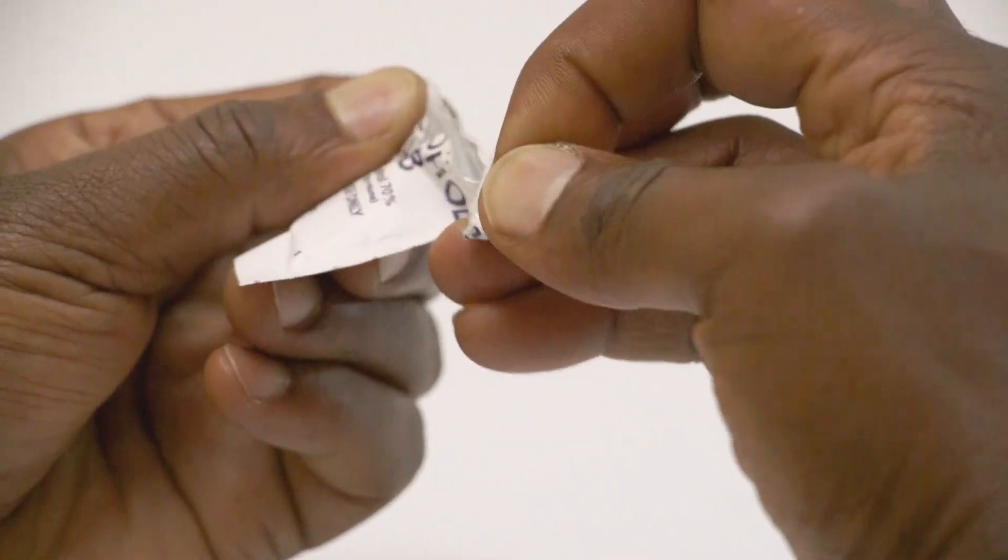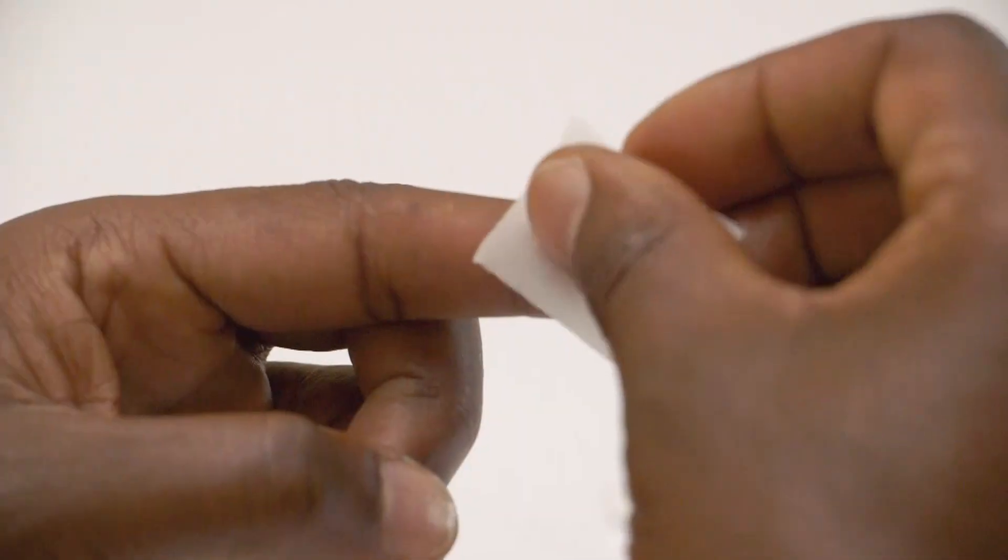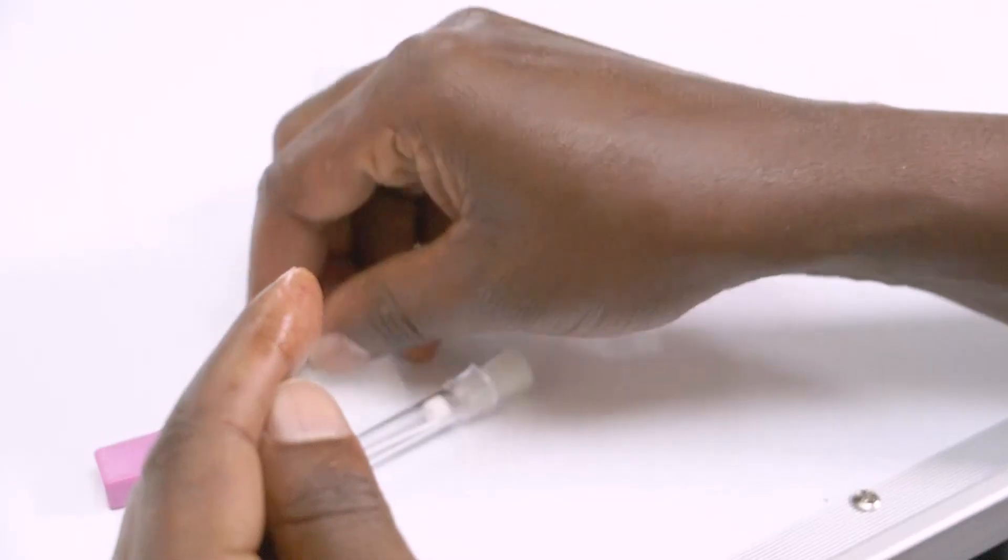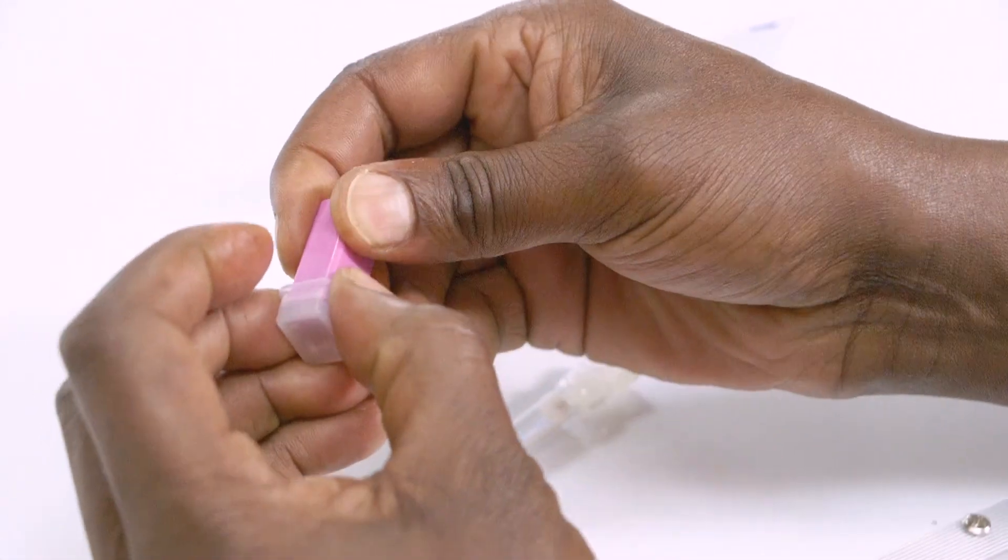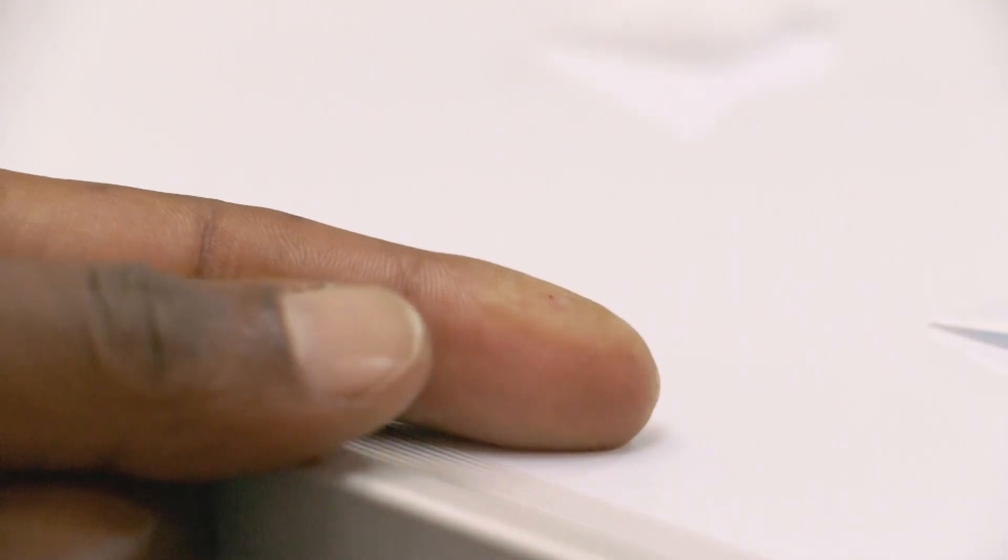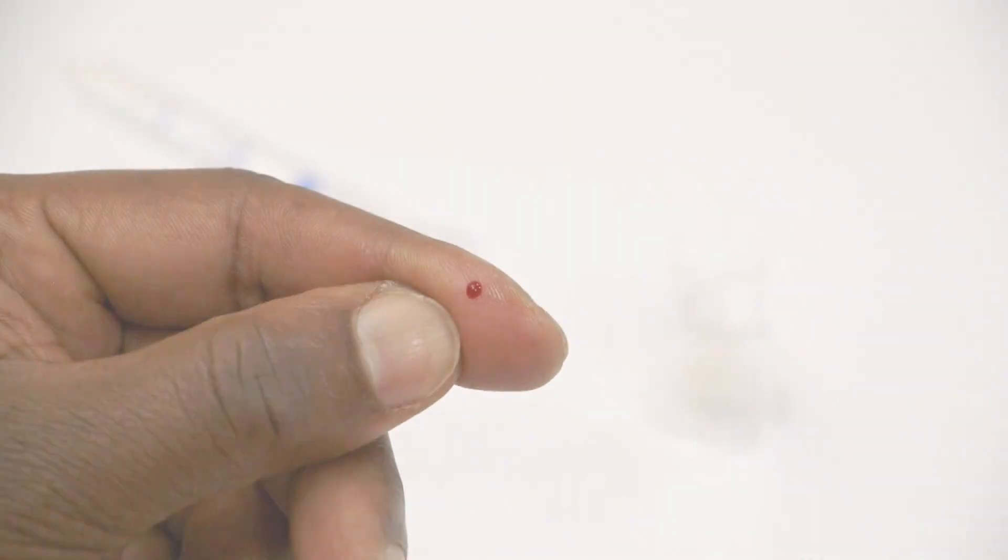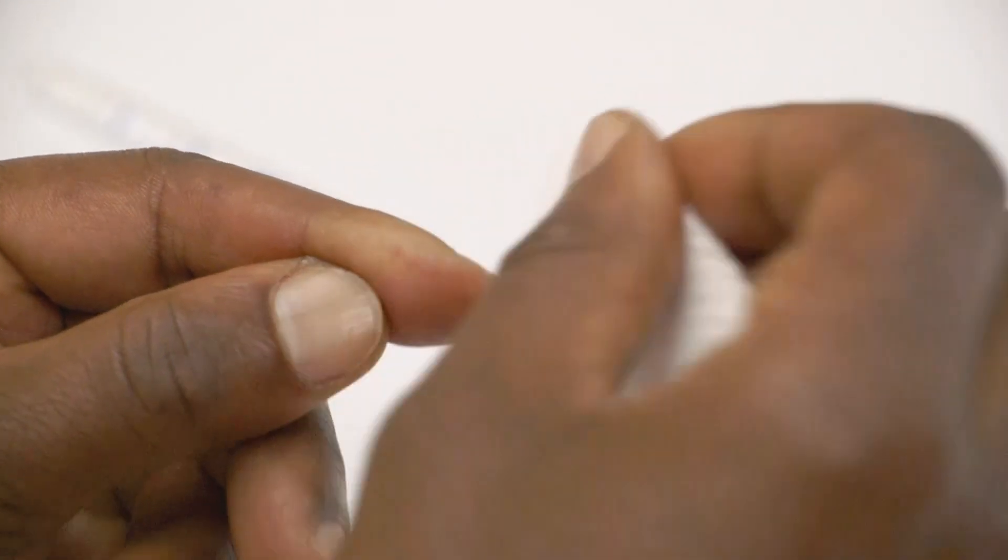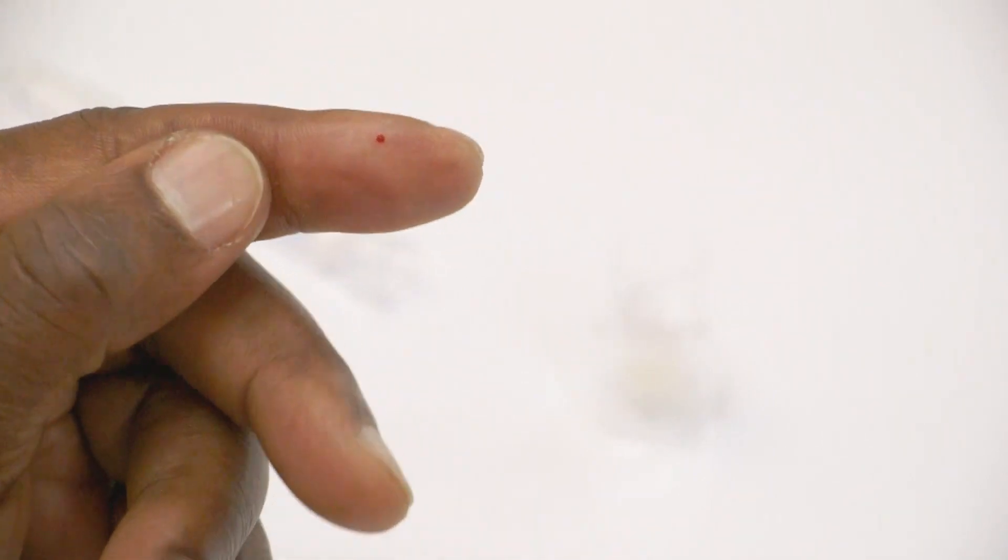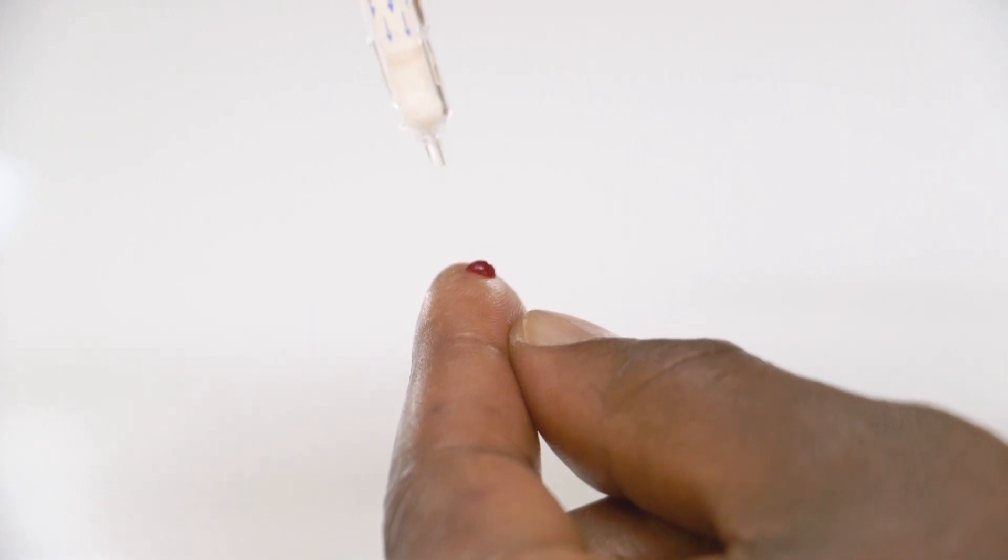Open alcohol swab and sterile gauze pad. Clean finger with alcohol swab. Uncap the safety lancet. Prick your skin and squeeze out the first drop of blood. Wipe away first drop of blood with sterile gauze pad. Squeeze out second blood drop. Fill tip of testing device with blood.